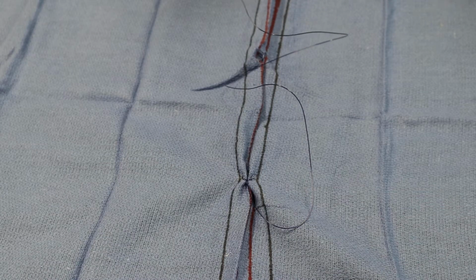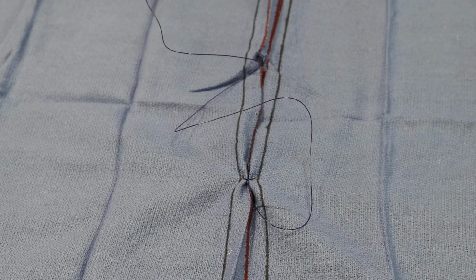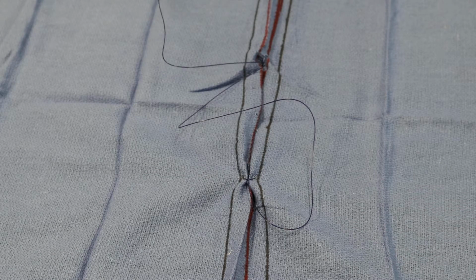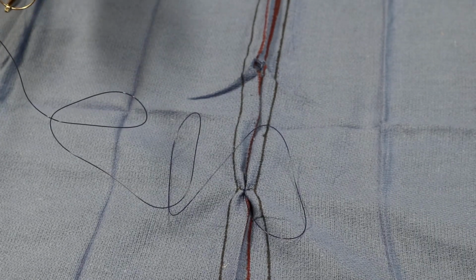Okay, so the difference between this one and let's say Utrecht or the Connell, Cushing, and Utrecht are different than the Lembert, because with the Lembert you would continue because you have a deep bite and you would just keep going with the Lembert, deep to superficial and then superficial to deep. With the Cushing, Connell, and Utrecht, you start with a superficial bite. So what you're going to need to do now is go back and get superficial. So the next bite, if you're going to use a Lembert to start a Cushing, is a deep to superficial bite, or a red line to a black line bite on the left side of the incision, so the non-dominant side. So you take that bite so that you can get back superficial.